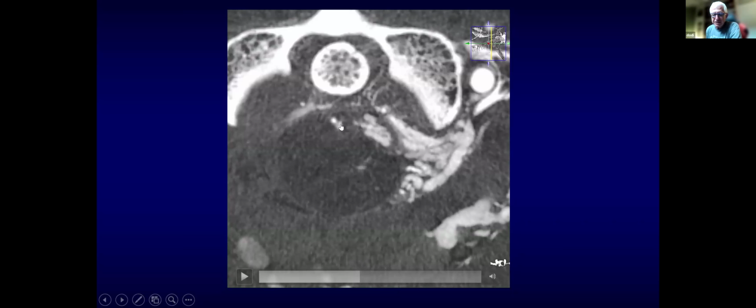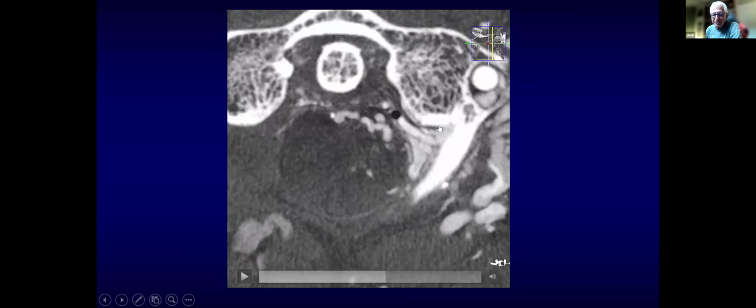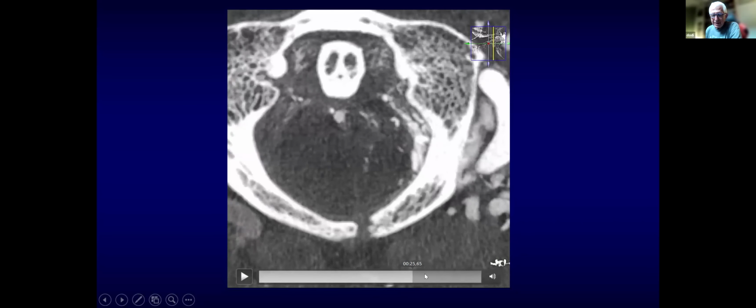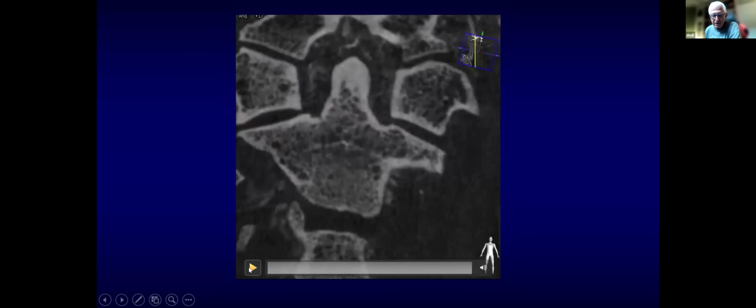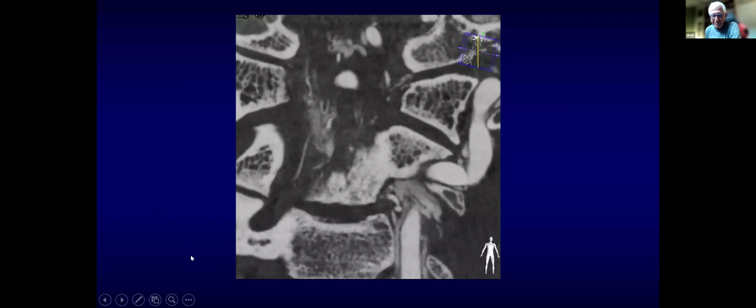It's on the surface of the spinal cord. Extradural is around here. So all these vessels are both extradural here, epidural if you like, and all these vessels are intradural or on the surface of the spinal cord. You can see this also on an AP view.